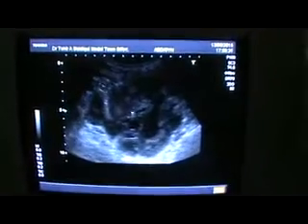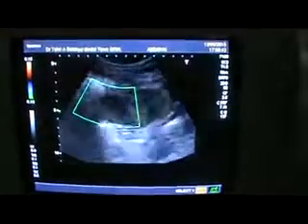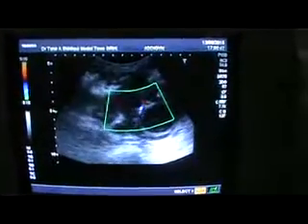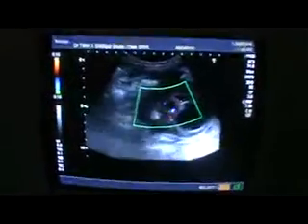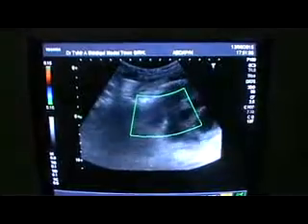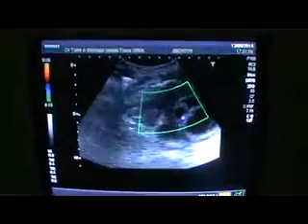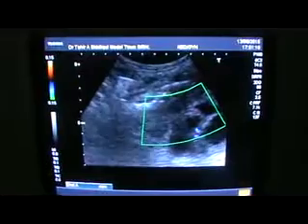Now here I am showing you both right and left adnexa. Right. What is the status of this mass? Let's see that. It is cystic, yes, as well as solid. You can see vascularity, both arterial and venous. If you see this bar, it extends up to the right lower abdominal quadrant, where again thick mesentery is seen. Here you are seeing thick mesentery.